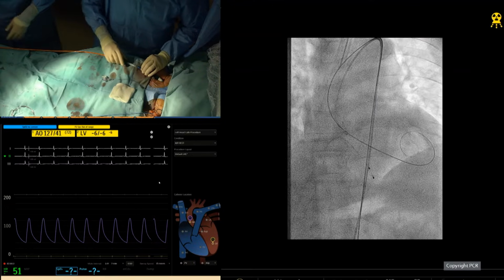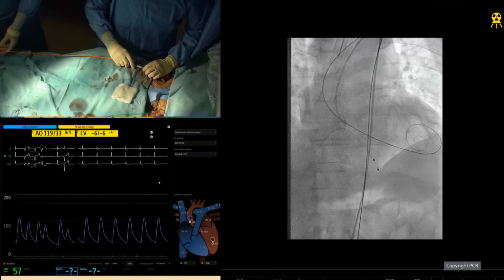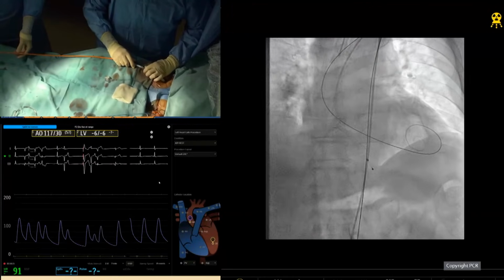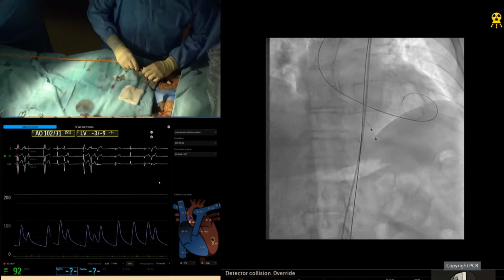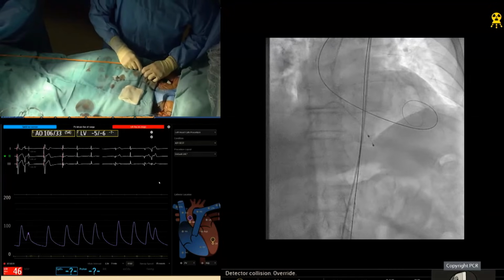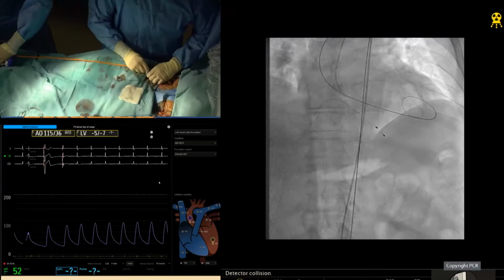So we're watching you continue the step by step. Can I see the tip of the guide catheter, please? Open wide, top and bottom. Okay, so we have a 21.5 millimeter Myval prosthesis that's crimped and aligned. We're delivering it now through the sheath. Very easy delivery. As you can see, I'm hardly pushing.